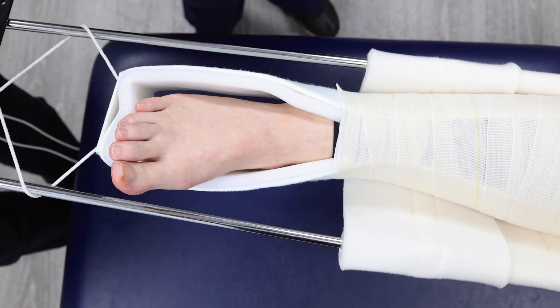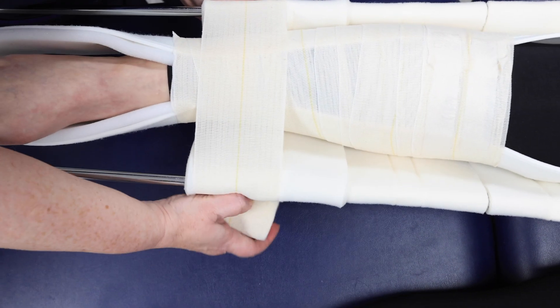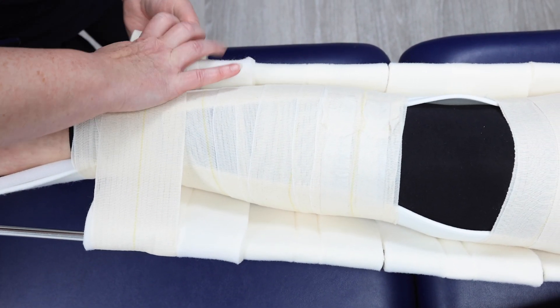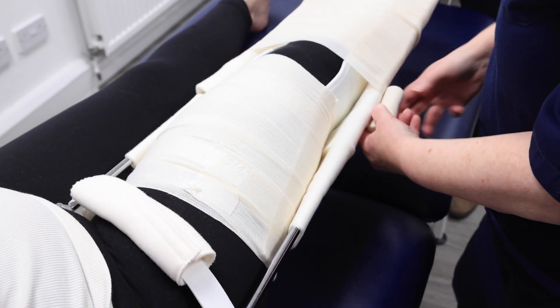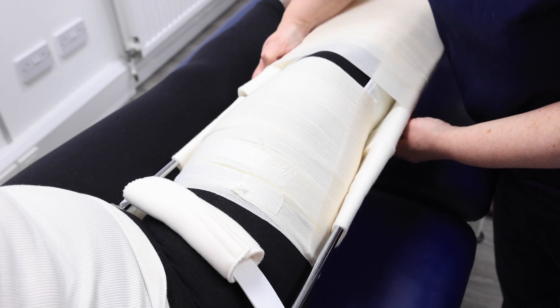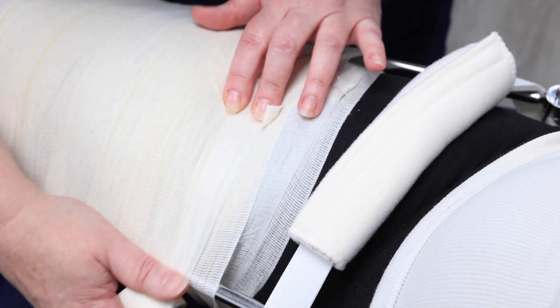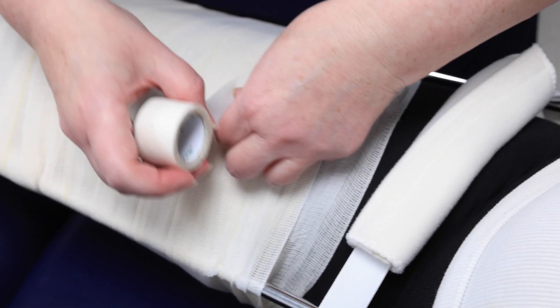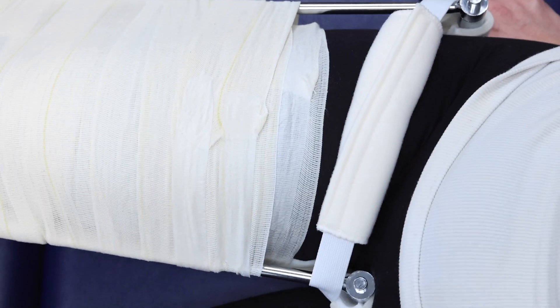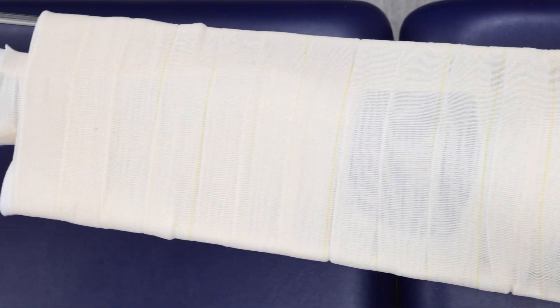Final securing for transport. For additional security, bandage the patient into the splint — a second clinician should elevate the leg to assist. Secure with tape as before. That's how you apply skin traction with the Thomas splint.